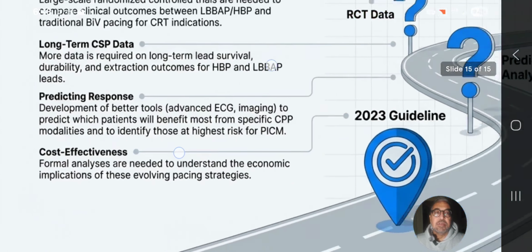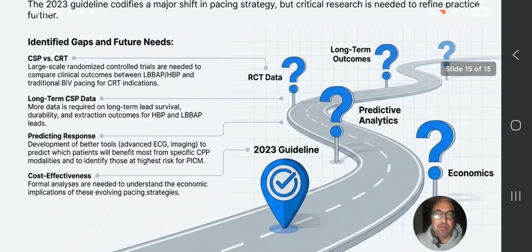It should also be noted that not everybody who gets a right-sided pacemaker automatically develops pacemaker-induced cardiomyopathy.